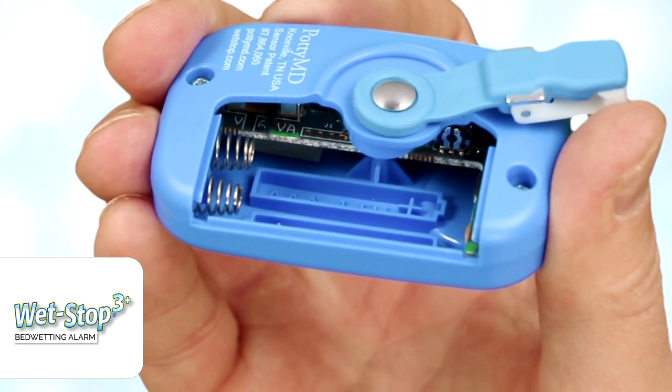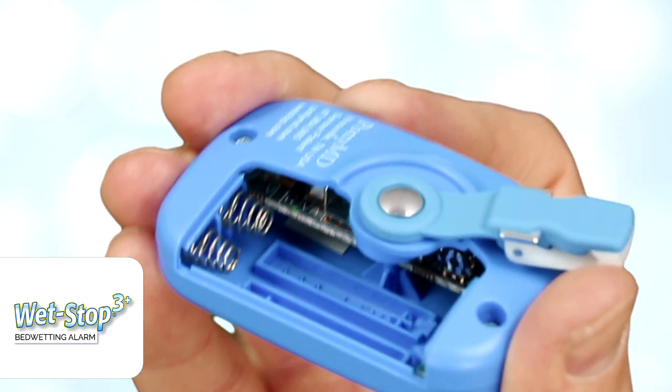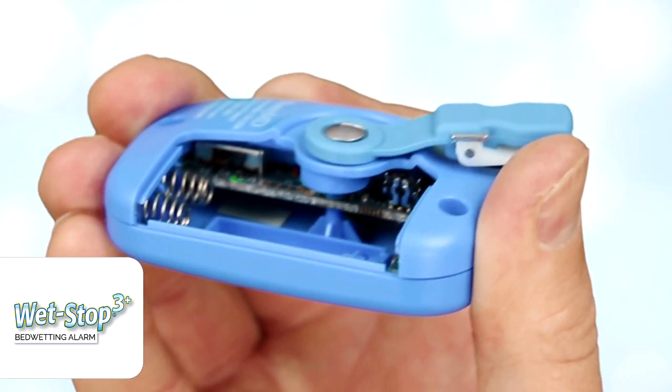Inside — and we'll show you a close-up — there is a switch with settings labeled A, V, and AV. A is for alarm, which is the sound alarm. V is for vibration, and AV is for alarm and vibration.